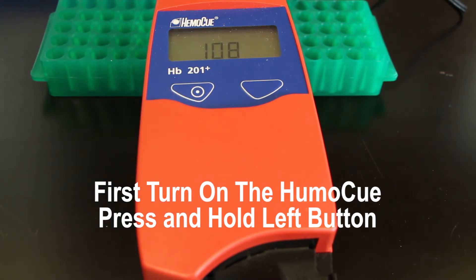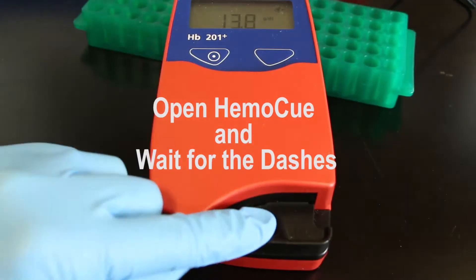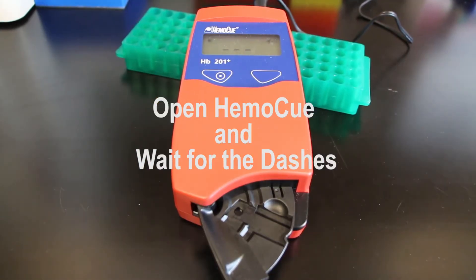Turning on the HemaQ is just a matter of plugging it in and pushing the power button. Then you're going to pull out the little black part of the machine at the bottom end, sliding it out towards yourself at an angle.